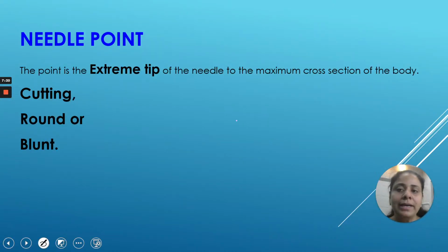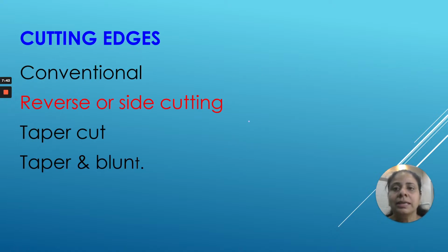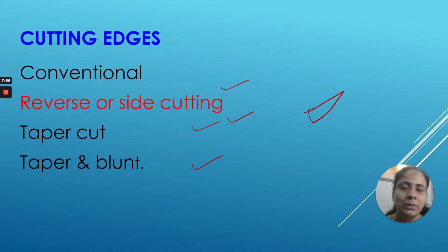So the needle point is either cutting, round or blunt. Blunt needles are not commonly used in the oral cavity. Cutting or round body needles are mainly used in the mouth. Then the cutting edges, so this is the edge of the needle. It can be conventional, reverse cutting, taper cut, and taper and blunt. Just go through these slides once, and your theory part will be clear.